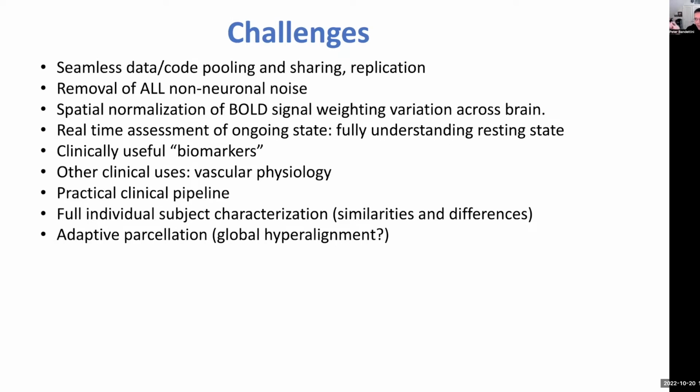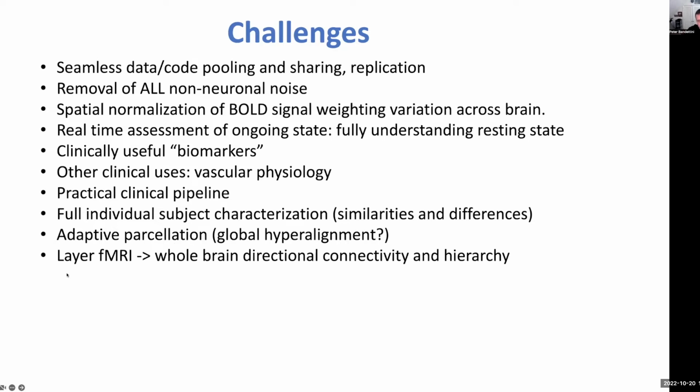Right now, the way that much of fMRI, especially resting state data analysis, is done is that you parcellate the brain, and there are several parcellations, and then you average all this, put all the subjects in this single parcellation, and then look at the correlation matrix. Well, each subject probably has a unique parcellation, so if you apply a template parcellation, you're probably mixing more signals than you want. That's what I'm talking about with adaptive parcellation. I'll even talk about even more of a caveat to that.